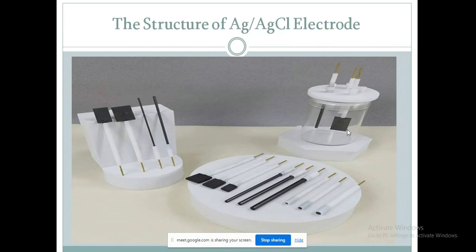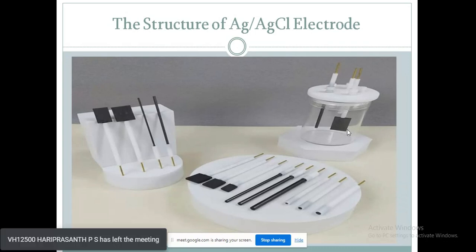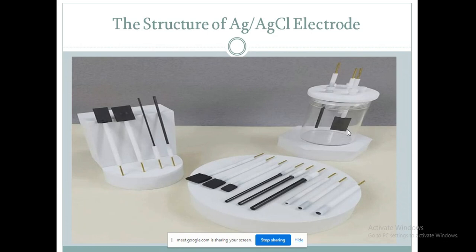In a coaxial tube, the AgCl electrode is kept at the central position and the potassium chloride solution is filled around the electrode. Calomel or mercurous chloride electrode is another popular reference electrode we may use. Here, we may also use a potassium chloride salt bridge for measuring with the electrode for a long time. So, the calomel electrode is very stable over a long period.